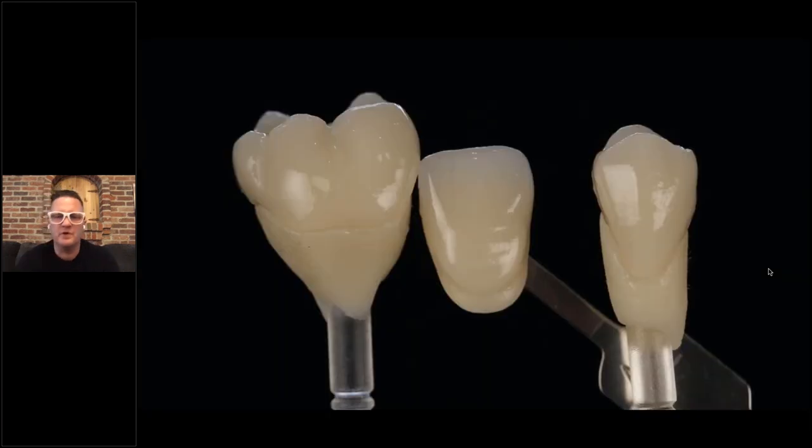And then of course, overall, I shaded a few of them. I pressed it out of A2 and then I shaded it. I didn't really have to do much shading, but you can see I put the tab in there to show. These were some of the very first LiSi Press units that were pressed in North America. I have to say that for sure, because Europe always has everything first. We won't get into that.